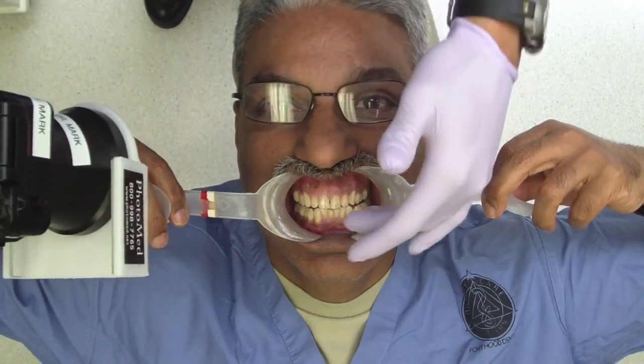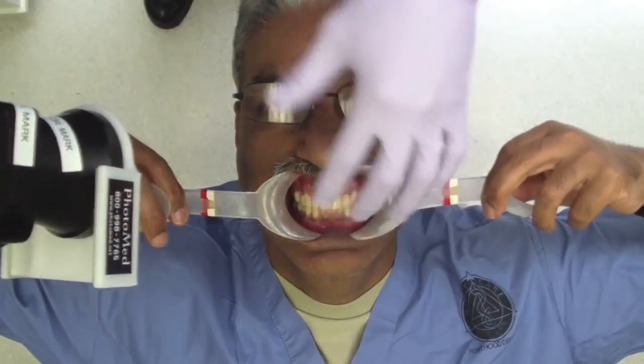So the next shot, just bite down for me regularly. The next shot we're going to do is our buccal shots. Now, one of the tips that we've learned is, hold on. It's taken me 2 years to learn how to say this. This is what I try to tell the patient. We're going to keep the retractors in. You hold on to your left hand. I'm going to take the right one. See, he took it out too. Just let go. We're going to keep the retractors in.